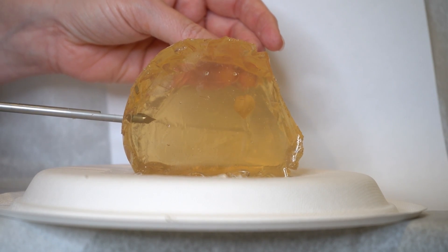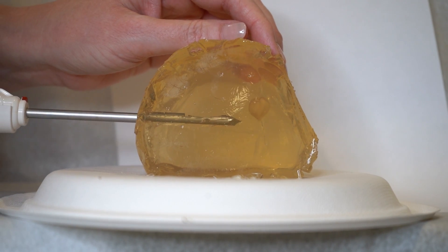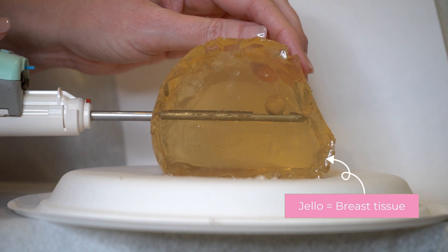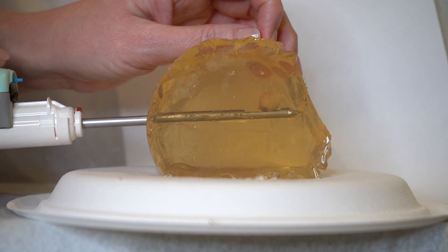What we're going to show you today is we're going to take our probe and direct it underneath the lesion. We do this with ultrasound guidance, but for these purposes we're just placing it underneath the lesion. Then we're going to see this door open up, and as the door opens and closes it's taking bites of that lesion, and as we pass upwards we see that the lesion is being removed.